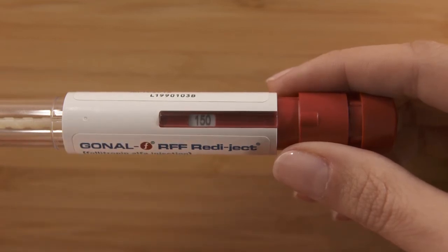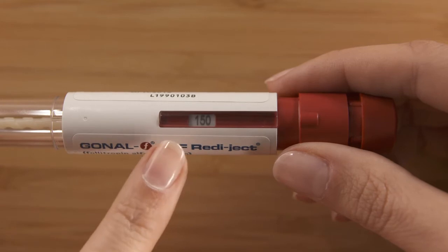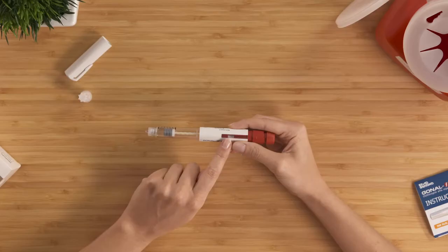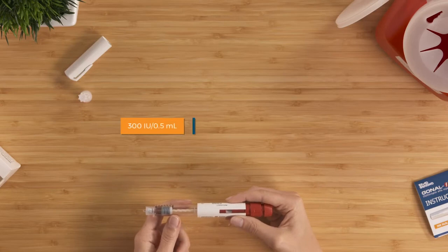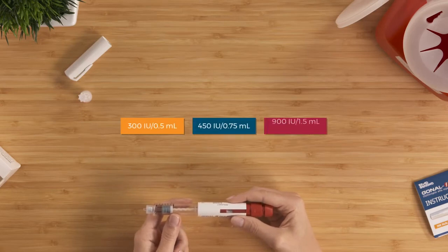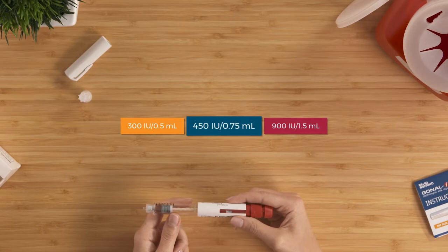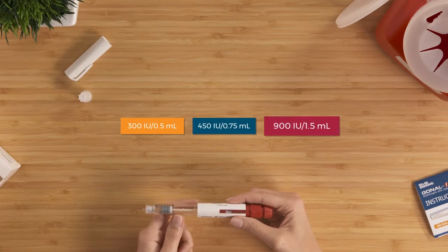For example, if your intended dose is 150 IU, confirm that the dose information display reads 150, like so. IU is short for International Units of Medicine. The pen comes in three different IU amounts: 300 IU, 450 IU, and 900 IU.